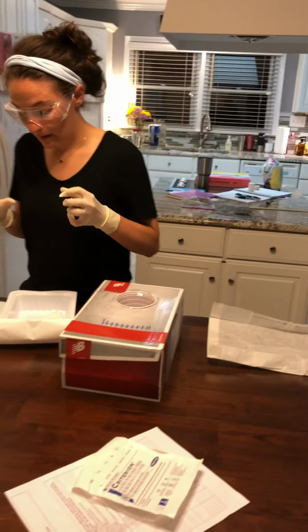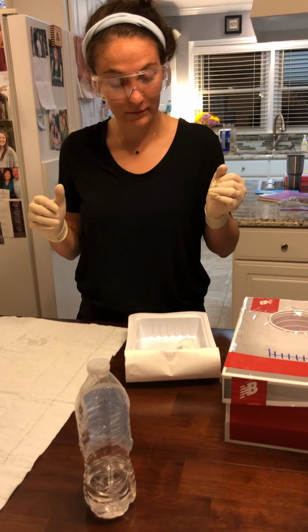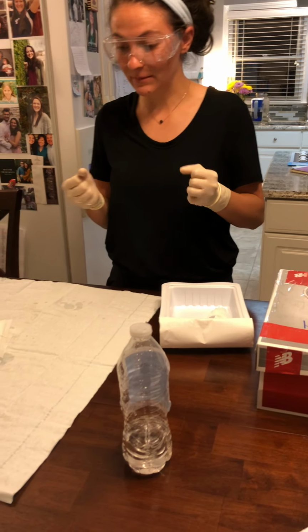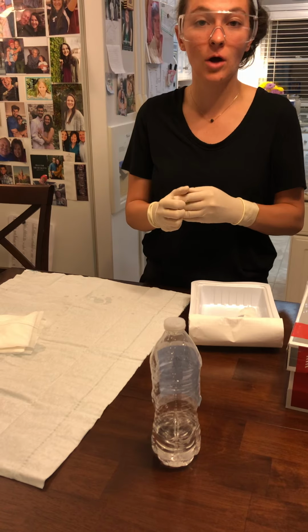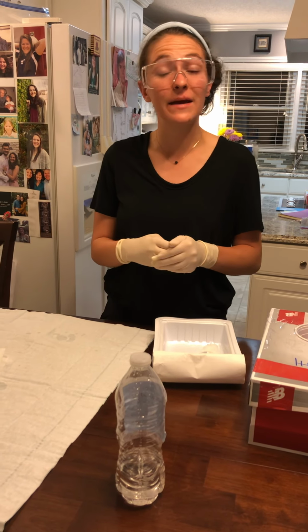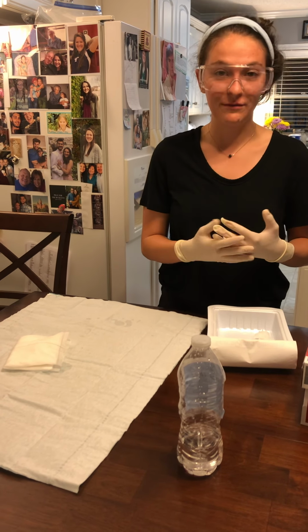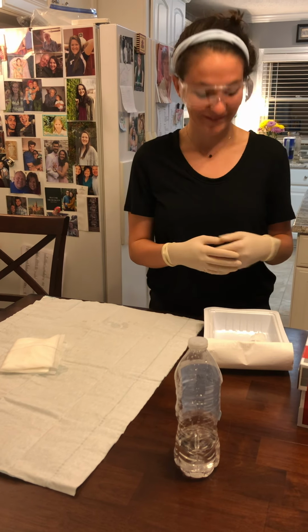Okay. You might notice that my sterile field has a little bit of dampness, and that's because we've reused the gauze just recently. So it's not because I have contaminated it during this video, but because of previous gauze not drying out.